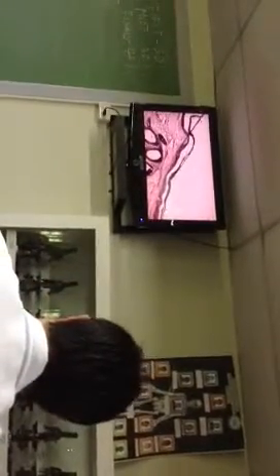This is the only part you will study, the one at the end. From that point to that point is the epidermis. Below this, from that point to way below, is the dermis.